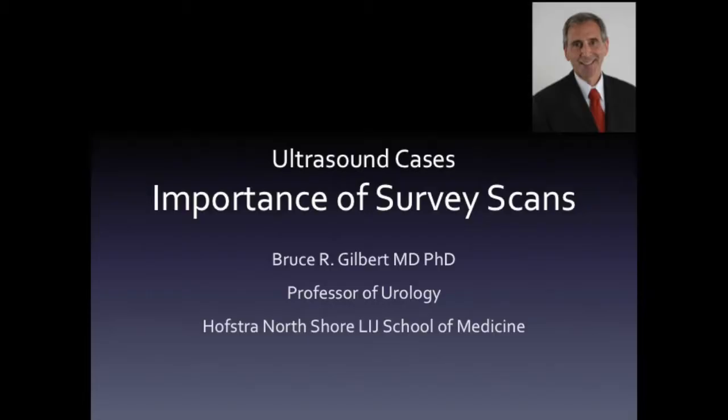The sonographer should, at the completion of the survey scan, be able to state whether the organ has pathology or not. Oftentimes, when a survey scan is not performed, pathology is missed. Recording the survey scan can also allow others that may not have been present during the live scan to confirm the findings of the sonographer who performed the study. I will present several cases to highlight these principles.